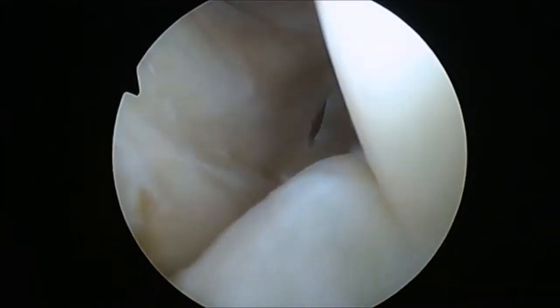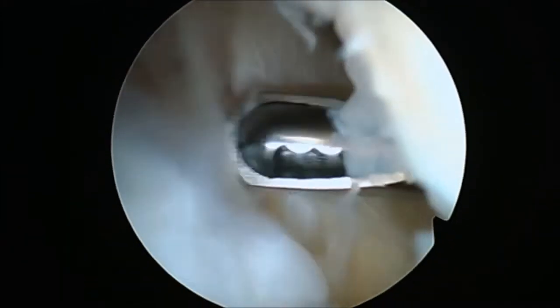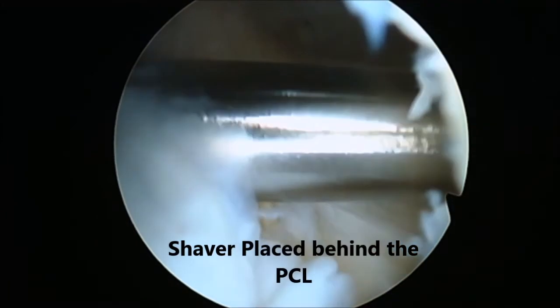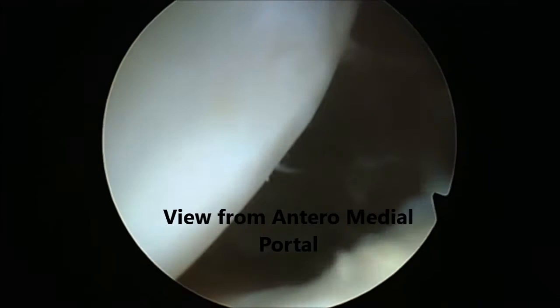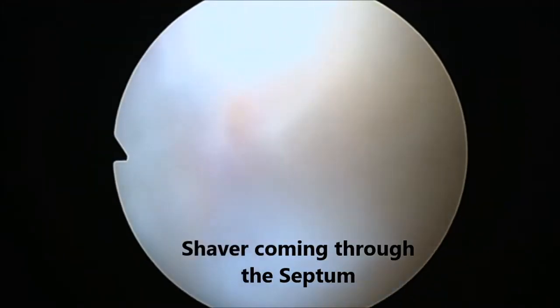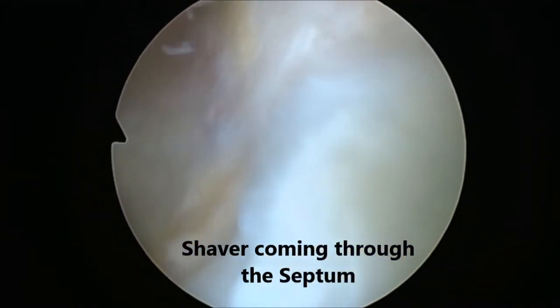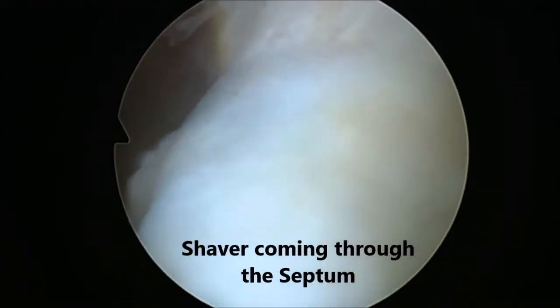A shaver blade is inserted in this portal in the direction of the posterior septum and placed behind the PCL. At this point, the camera should be switched to the anteromedial portal. After locating the position of the tip of the shaver on the other side of the septum, it is turned on, creating a small hole in the wall of the septum. This is what will allow the handling of instruments in the posterior compartment of the knee.